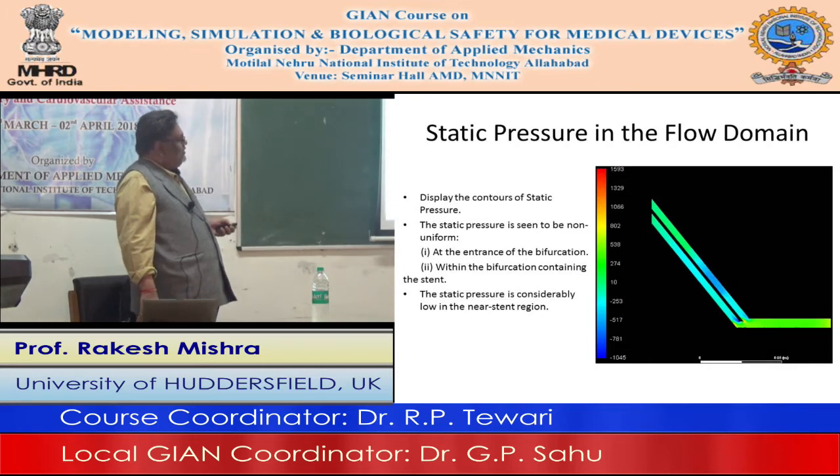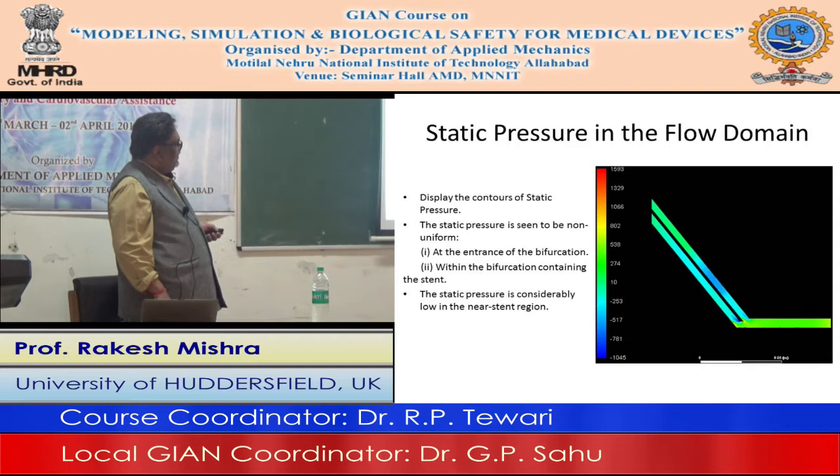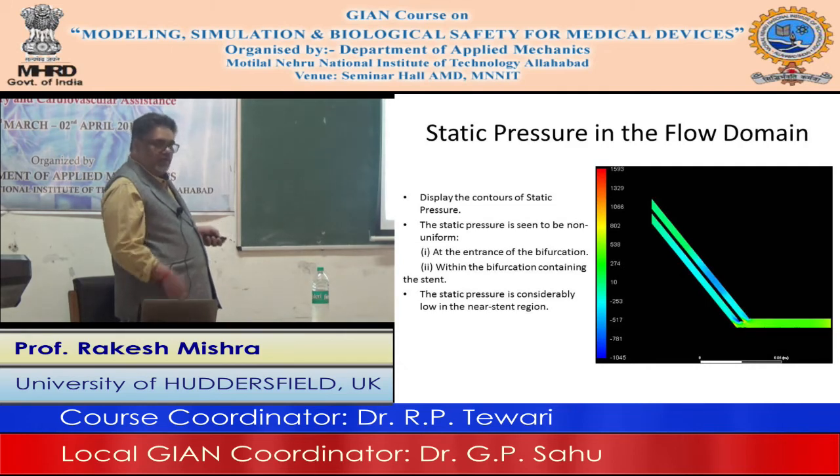Pressure in the two arterial system, one with stent and without stent, is different, and pressure is considerably low near the stent. Your stent is somewhere here, and you can see the pressure is quite low in the stented part. And this is the qualitative explanation for this, and now we can go for the further analysis.